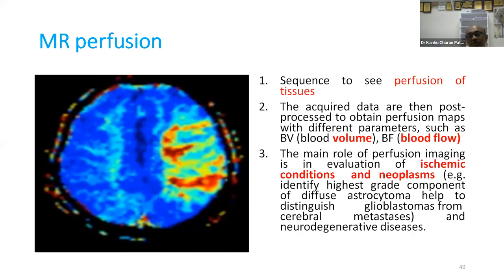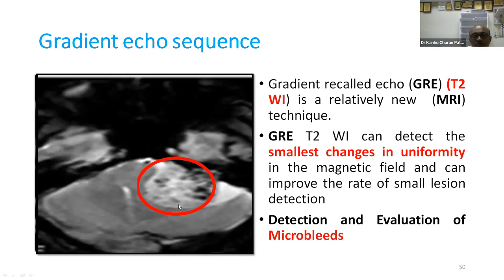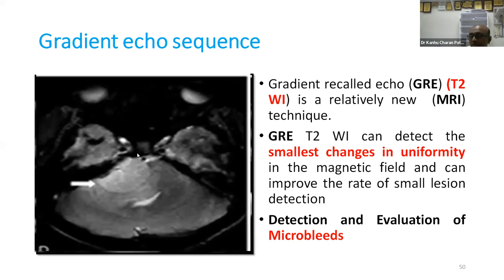MR perfusion sequence is important when new angiogenesis occurs in high-grade tumors. It helps differentiate necrosis from recurrence and progression — perfusion study shows color-differentiated areas indicating malignancy and vascularity. Gradient echo sequence shows a blooming effect in schwannomas due to microcysts and bleeds, while meningiomas do not show this blooming effect, helping differentiate CP angle tumors.